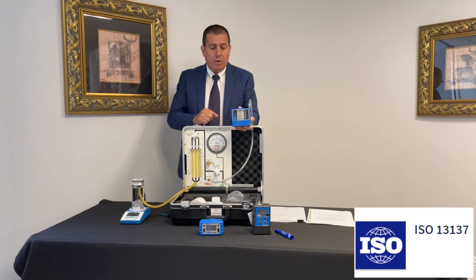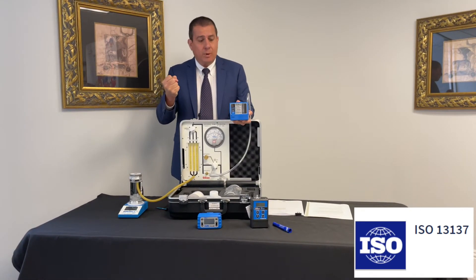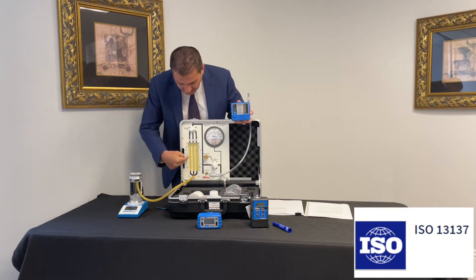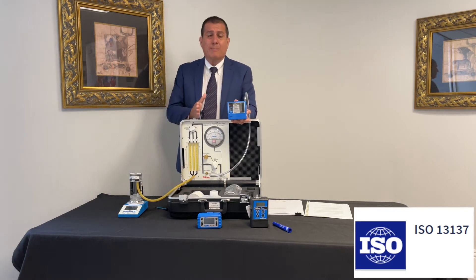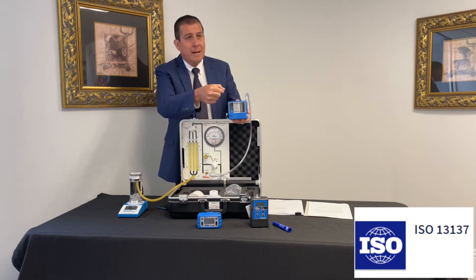This is very important when you're working in the field, so that if your filter gets clogged for one reason or another, the pump is able to compensate, as you can see here. This is a very important performance check. The pump has shut off, and according to the ISO 13137 family, it tells you that you should be able to turn it off and back on again.